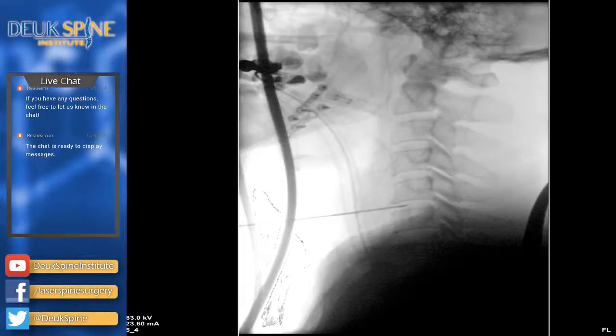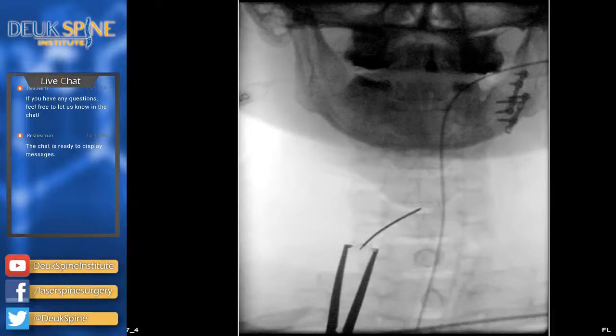So I'm in the disc. Come on, guys. I'm inside the disc that I need to be in. Perfect. I'm in the dead center of the disc. All right, good. So let's just stay there for a moment. We're going to do our discogram.